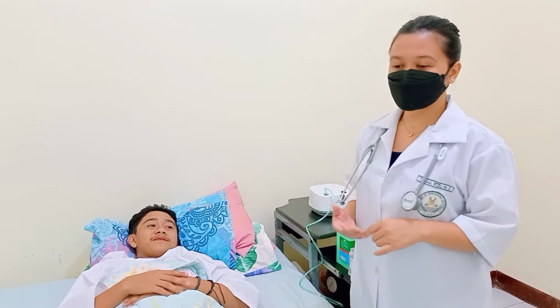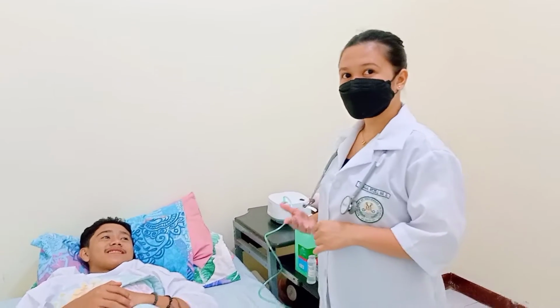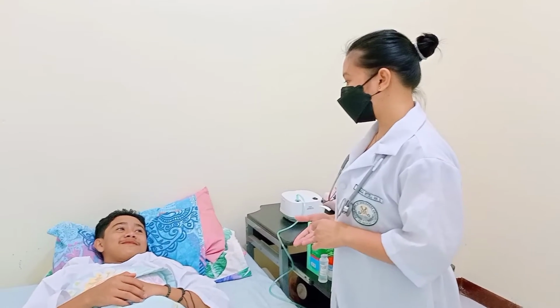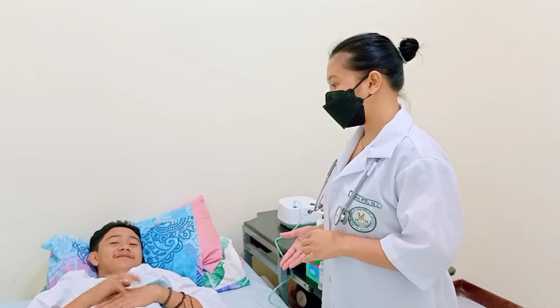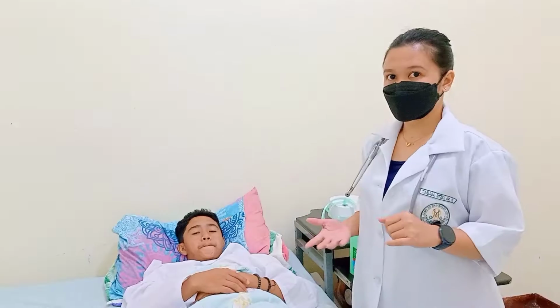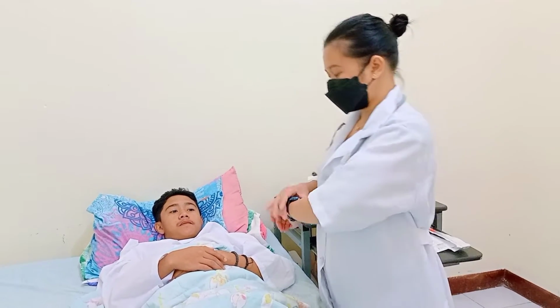For the assessment, assess the client for signs indicating the need for suctioning: restlessness, anxiety, noisy respiration, and adventitious or abnormal breath sounds with the chest. Also check the mental status. So sir, do you have any history of face surgery or head trauma on your face? Then next, check the vital signs of my patient.